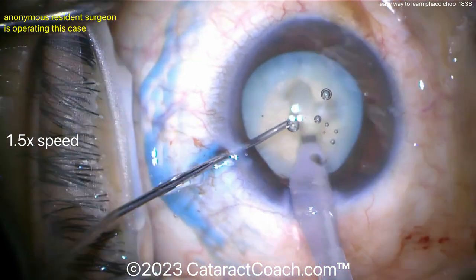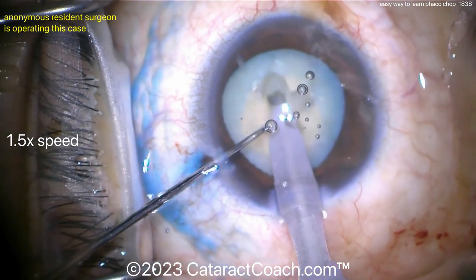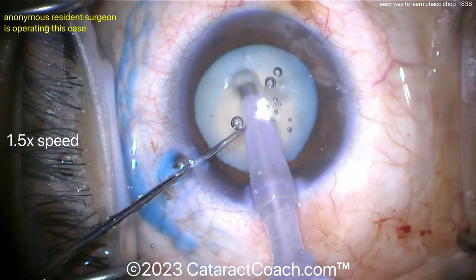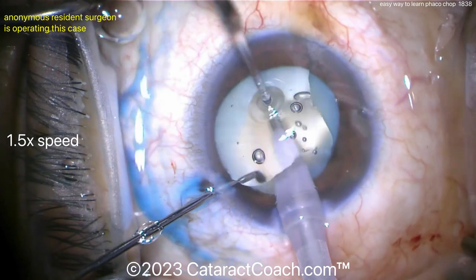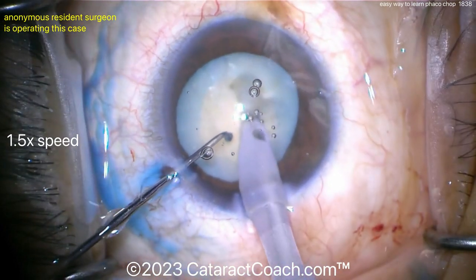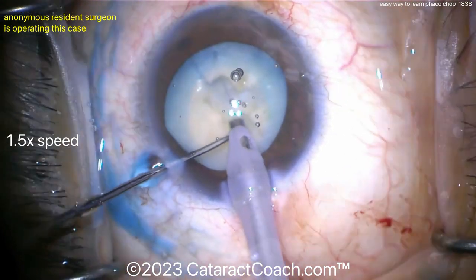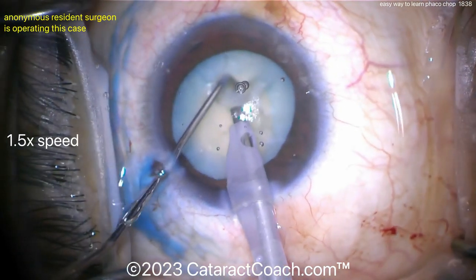A little bit more grooving here. You want to sub-chop the pieces as you bring them up. The resident is using a ball-tip chopper, which can give a little more sense of safety. You can see there's an attending squirting the eye. Now splitting — it looks like there's a hemi-nucleus and two quadrants. Rotating and getting them split. With white cataract, it's relatively easy to see a good split because it's so opaque.